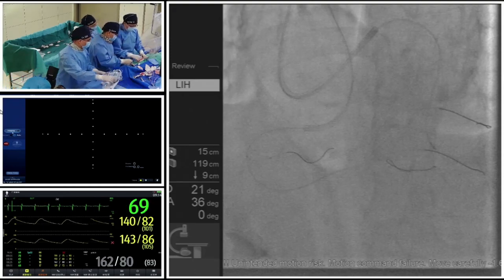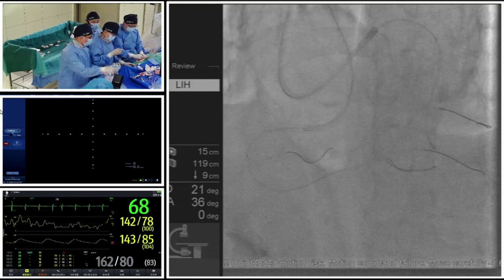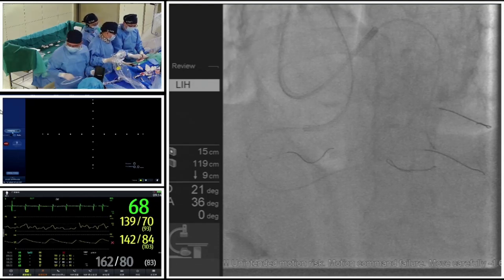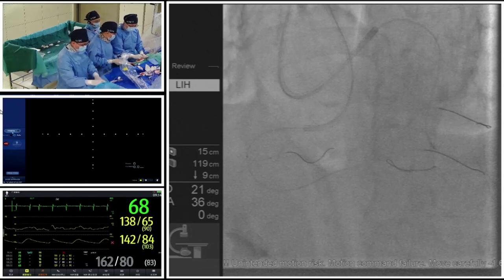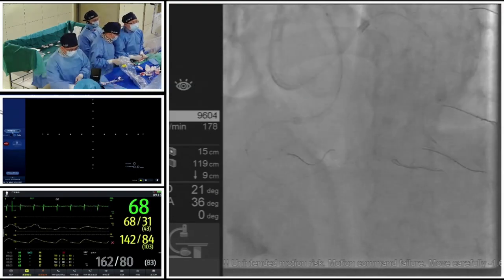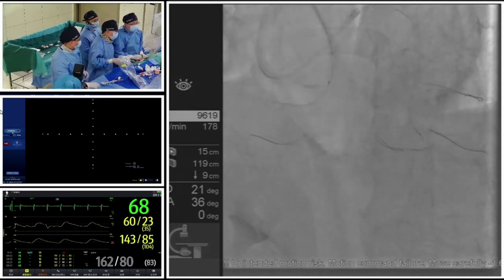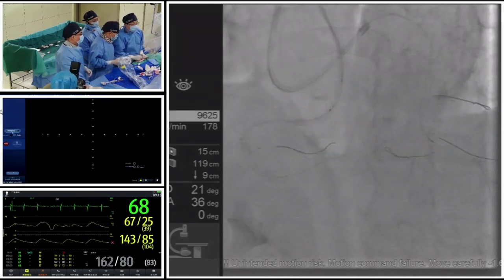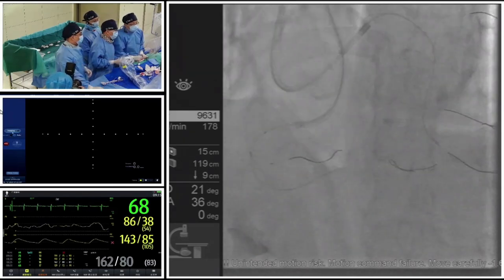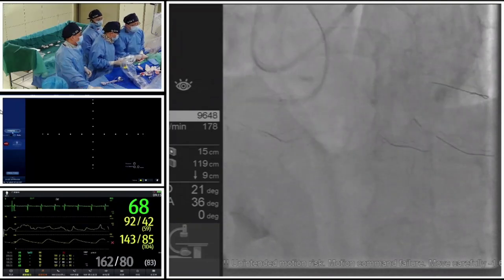But although this trick is important, I think many doctors perform antegrade injection to check whether it's in the true lumen or not. If it's intraplaque, microchannel crossing or loose tissue tracking, we could do antegrade injection, no problem. But for this case, we already did knuckle, and the wire must be in some segment inside the subintimal space. Okay, still strong resistance.